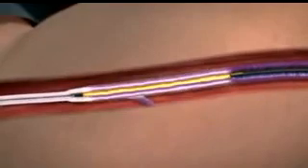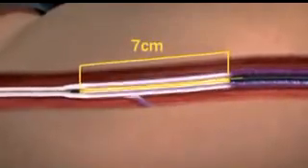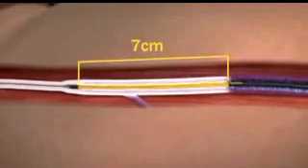The new Closure Fast Catheter heats a full 7 cm vein length all at once during a single 20 second treatment.